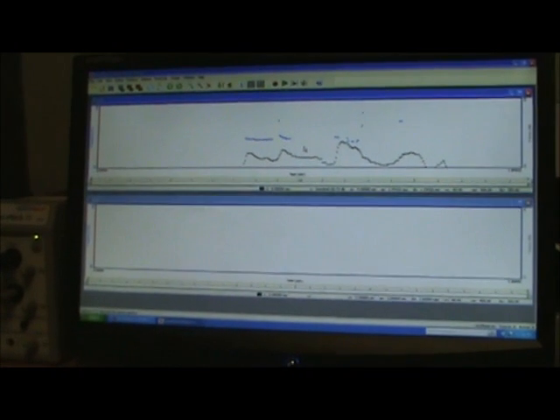And the key is you can't just take the lowest pitch they get. They need to be able to hold that pitch for at least 2 or 3 seconds. Okay, because you might get some spots where their voice is breaking at that low pitch, and that's really the case when you get up to the high pitches. That's not what you would call their basal or ceiling pitch. So they need to be able to hold it steady. I'll show you with the microphone.